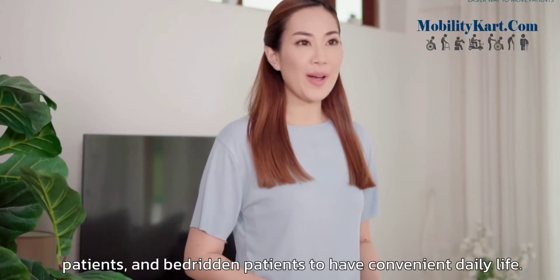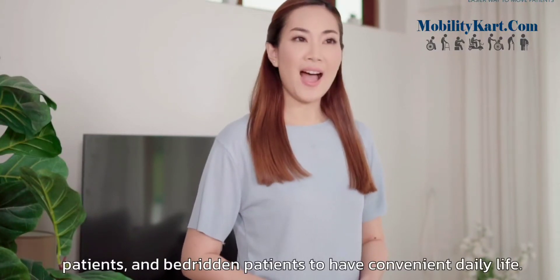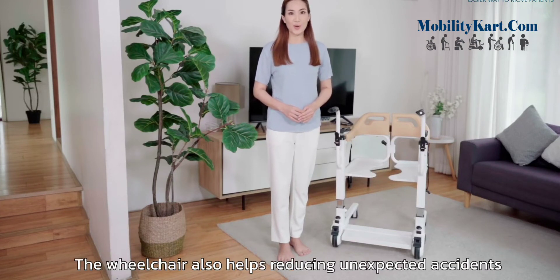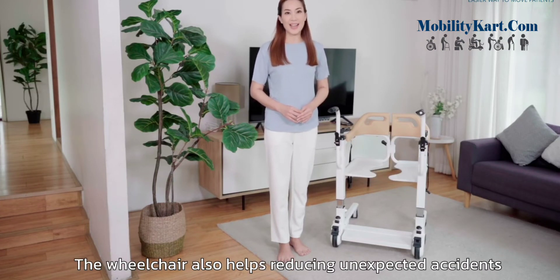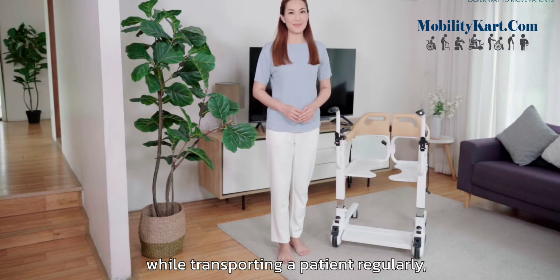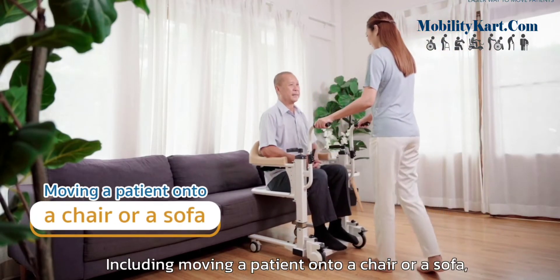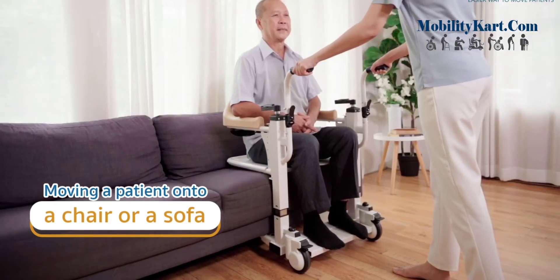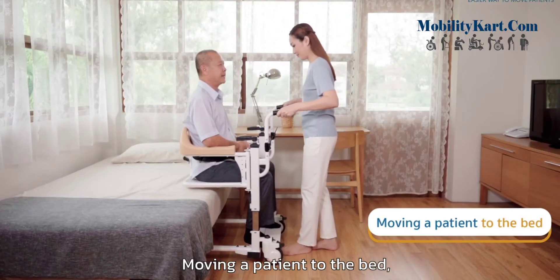Taking care of elders, patients, and bedridden patients to have convenient daily life. The wheelchair also helps reducing unexpected accidents while transporting a patient regularly, including moving a patient onto a chair or a sofa, or moving a patient to the bed.